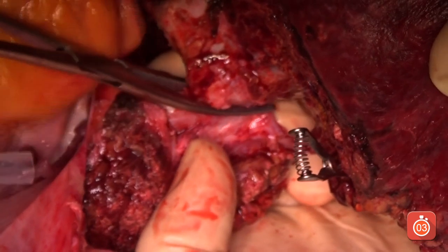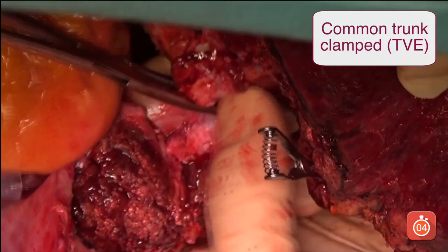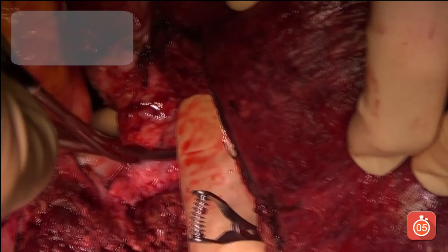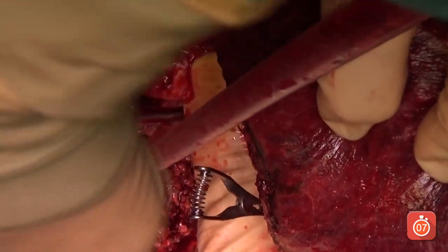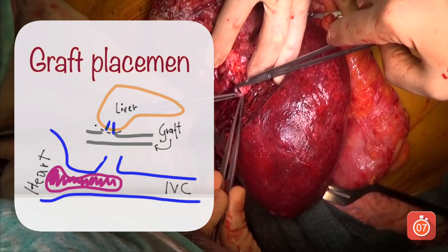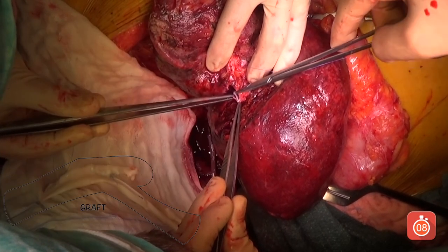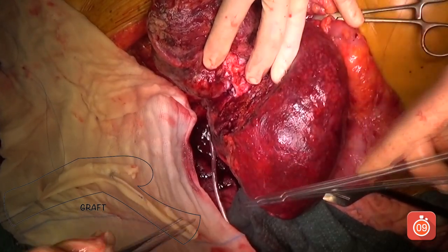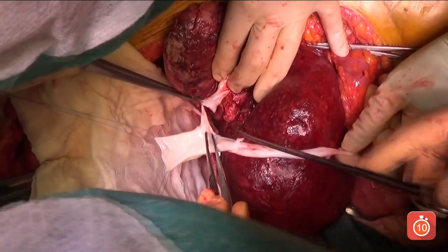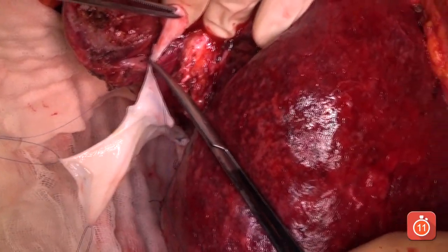The common trunk was clamped and sectioned with complete vascular exclusion of the liver, preserving the caval flow. The transposed iliac vein of the caval graft was sutured to the stump of the common trunk. The anastomosis was performed with a 5-0 prolene running suture.